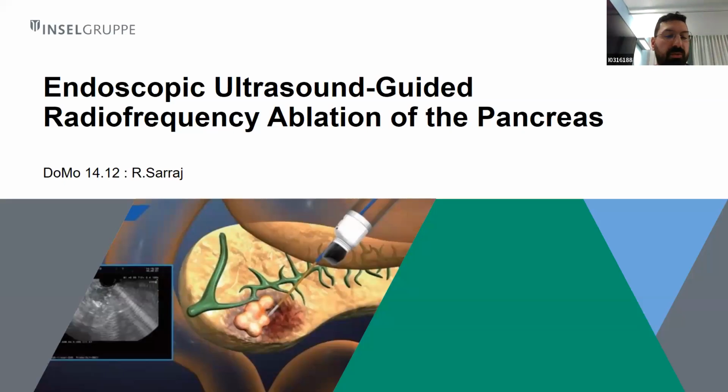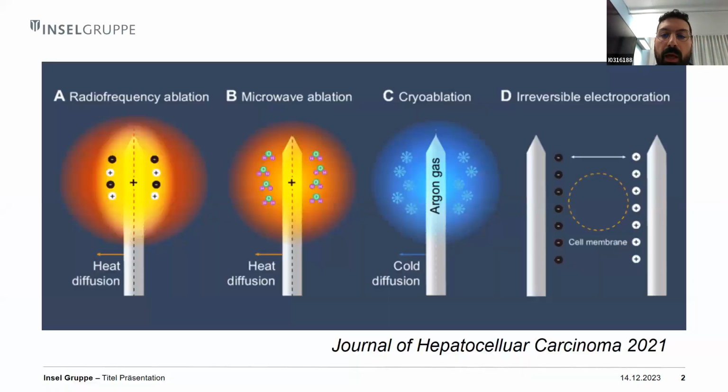Thank you for allowing me to present and discuss today the topic of endoscopic ultrasound-guided radiofrequency ablation in the pancreas. Among the established techniques for eradicating solid tumors, such as esophageal adenocarcinoma and hepatocellular carcinoma, is radiofrequency ablation, RFA.